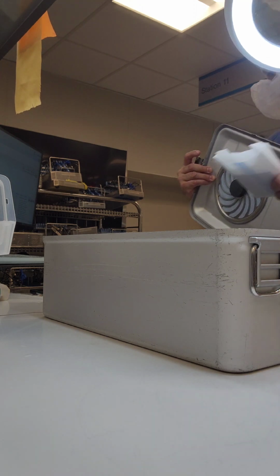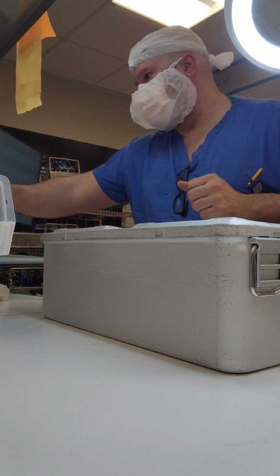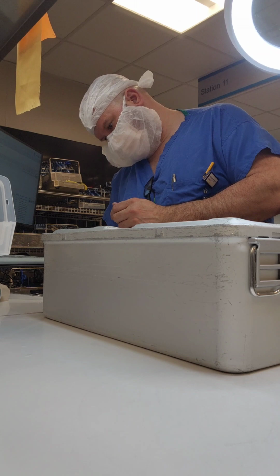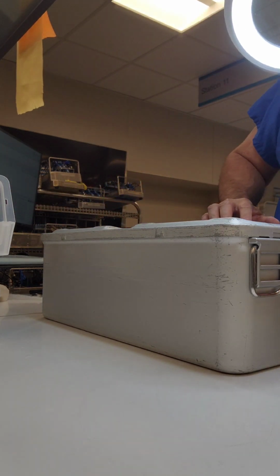Place my count sheet. Where's my count sheet at? There, go right there. Count sheet on top, and then that lid nice and secure. All right, put my box locks on. So got my container locks on both sides.